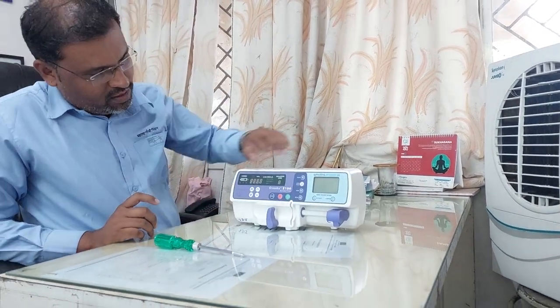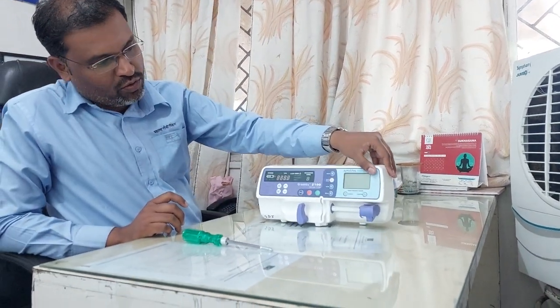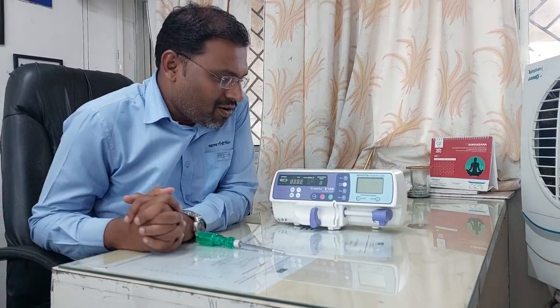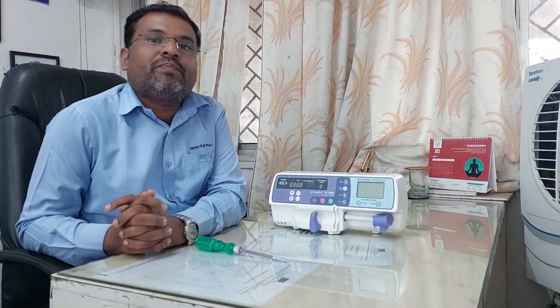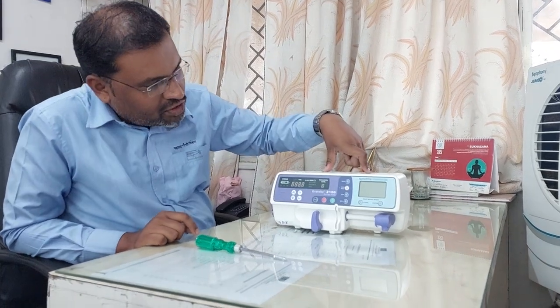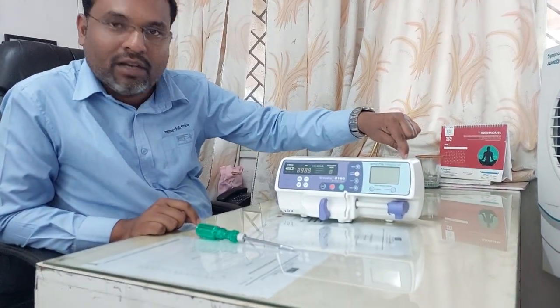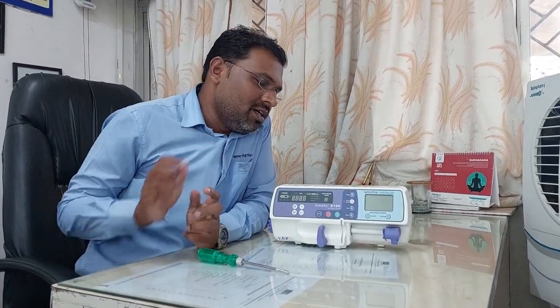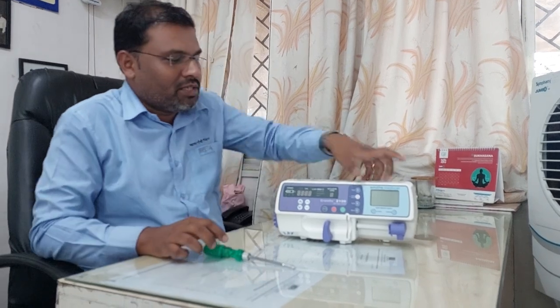Hello guys, today we are going to make another video of how to replace the battery of a Smith Medical syringe pump. You can observe this is a syringe pump made by Smith Medical. Sometimes such a syringe pump will not give you battery backup, and that is when we will replace the battery. So let's see how to replace the battery of this syringe pump.